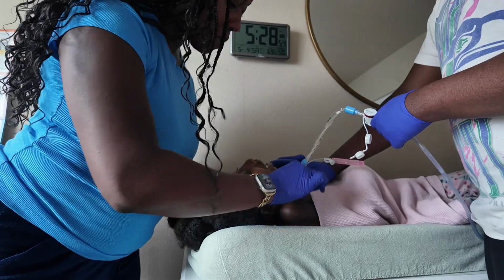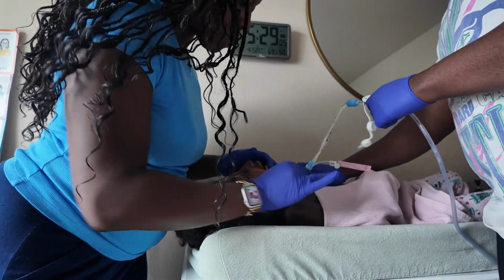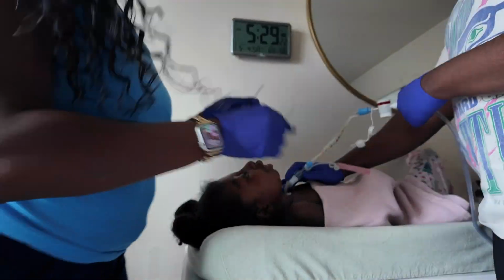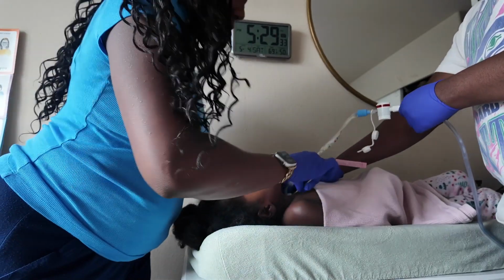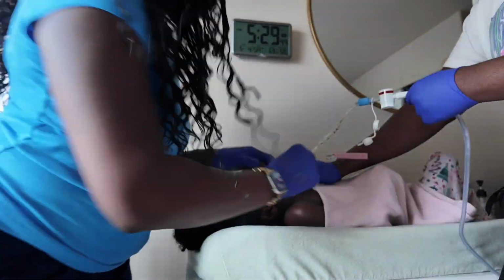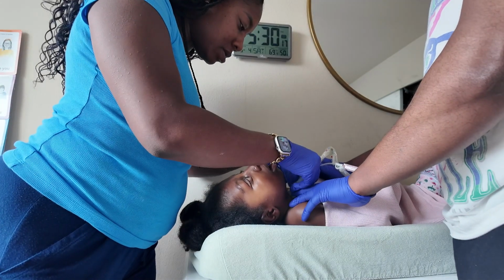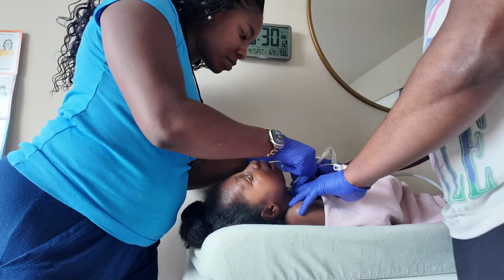So I've taken the ties off and I'm using those wet Q-tips to clean around the stoma, around the opening. And I'm using the gauze to clean around her neck. So I'm going to do that on each side. So I'm going to use the right side and clean, and then I'll do the left side and clean. Some people do it differently. I'm doing wet, then dry, and then I'll go on the other side. So I have just cleaned that area and now I'm drying the area. And now I will start on the opposite side and use the wet Q-tips to clean the left part of her stoma. And then I'll use the gauze to clean the left part of her neck.